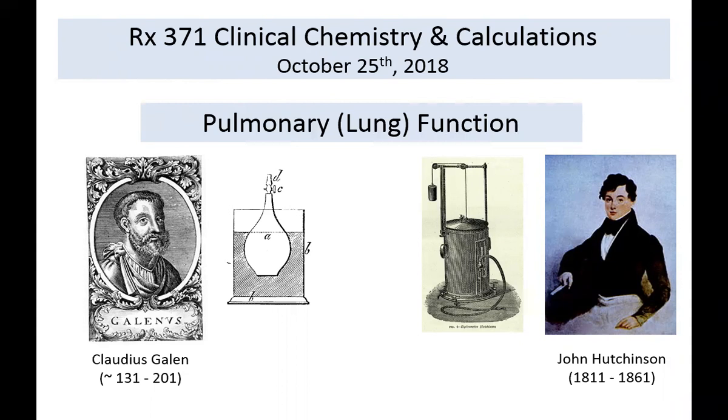So it's a way of measuring lung function in a fairly simple way. It's a small device, you blow into it, and it tries to measure your peak flow. And that's a good estimate of the state of the larger conducting airways. So it's good for looking at whether someone's at risk of asthma, or if they're developing the symptoms of asthma. The lung function we'll talk about will include that, but it's more complicated in terms of the test that you'll see if you go to a lab or a physician for lung function testing. And it's done with electronic devices now, but not always, obviously.